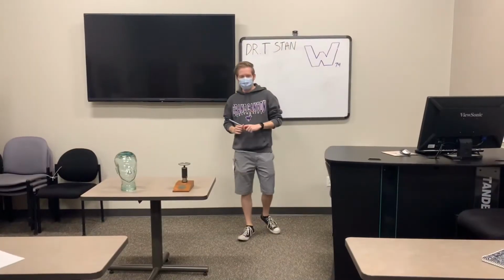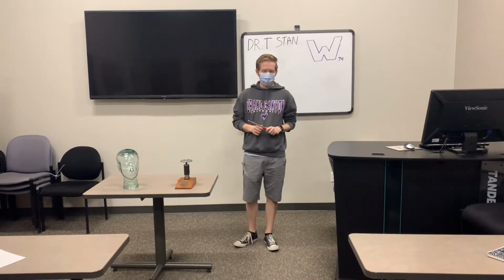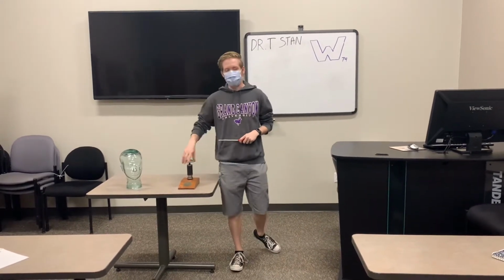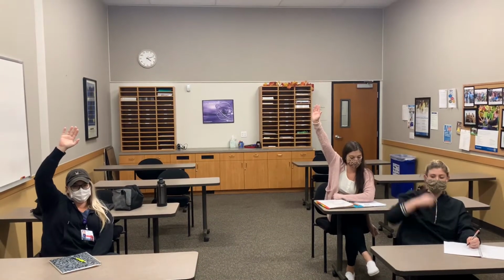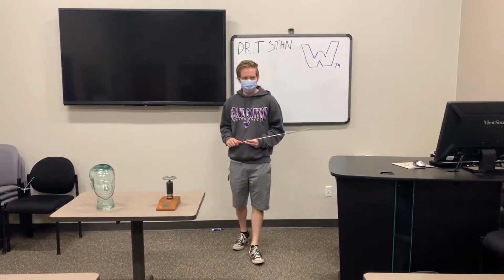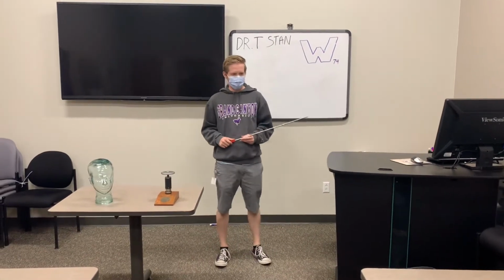Now, tungsten has a very important role in the X-ray tube. It's found in both the filament and the rotating anode. Who can tell me one of the properties of tungsten? Hannah? It has a high melting point. Okay, good. Anyone else? Jessica Pitts? It dissipates heat. Okay, I'll take it. Heather Guffey, what's the third? High atomic number. Now, over the weekend, I want you guys to submit videos showing one of the 3 properties of tungsten.